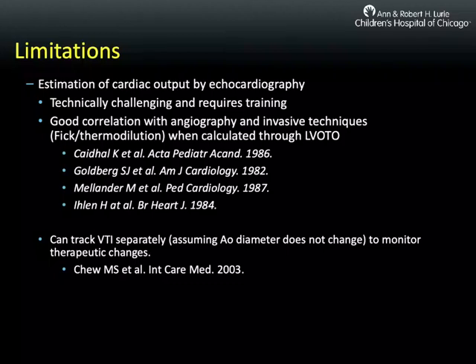This paper described how point-of-care ultrasound can guide changes in inotropes and follow cardiac dysfunction. VTI separately was helpful in being able to track that.